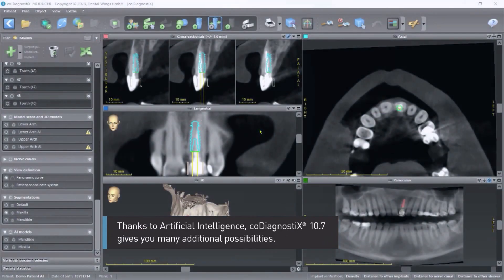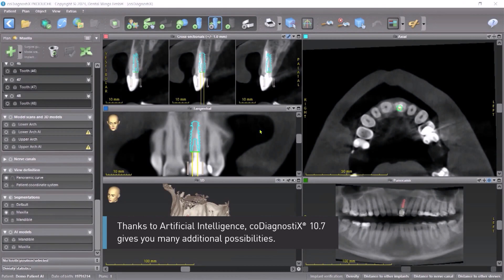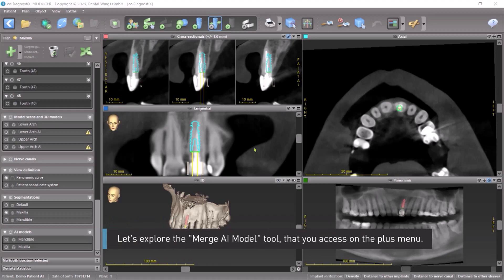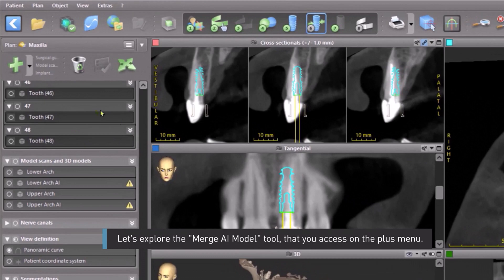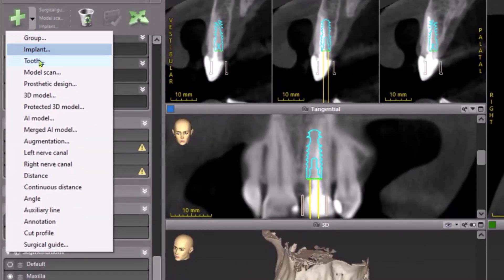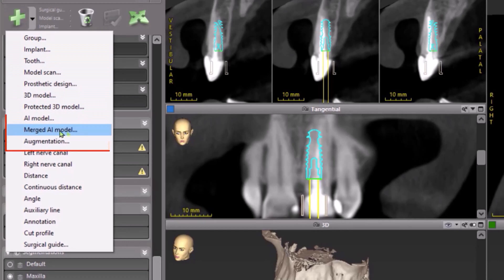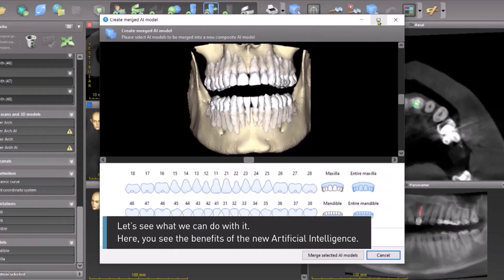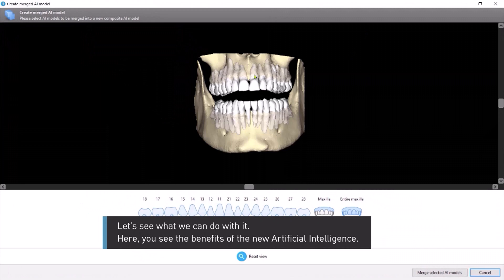Thanks to Artificial Intelligence, CoDiagnostics 10.7 gives you many additional possibilities. Let's explore the merged AI model tool that you access on the plus menu. Here you see the benefits of the new artificial intelligence.